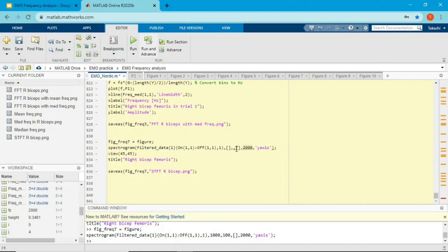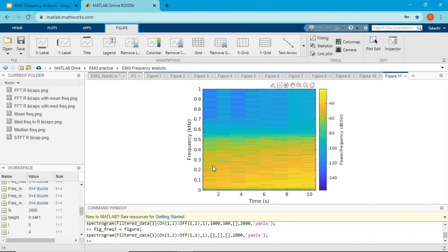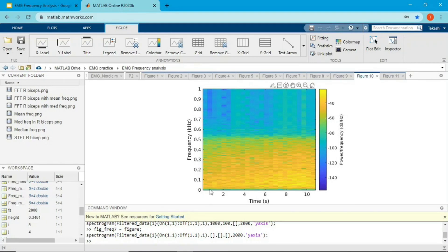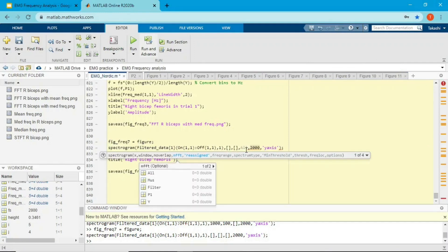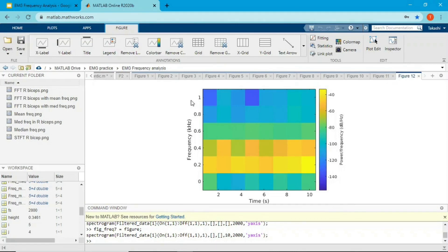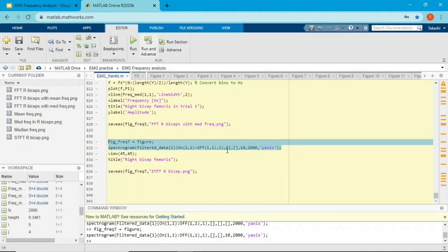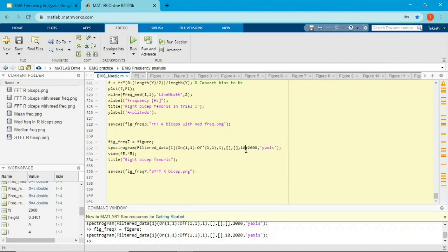With default settings you only get around 8 time bins, but with a 1000-sample time window and 100-point overlap you get many more bins and finer time resolution. If you change the frequency resolution parameter to something like 10, you get very few frequency bins — only around 6 — which is low resolution. You can play around to find the best value for your EMG data.